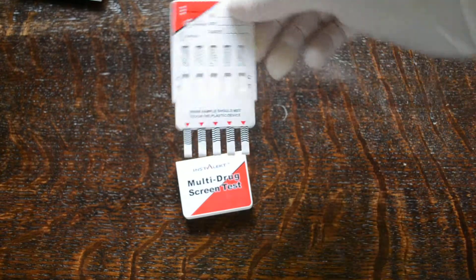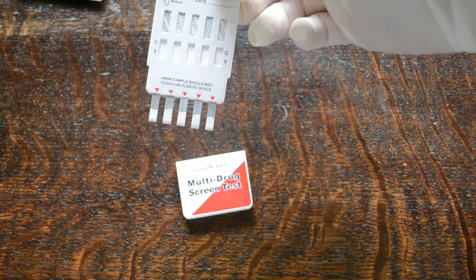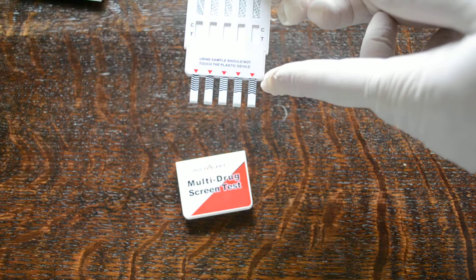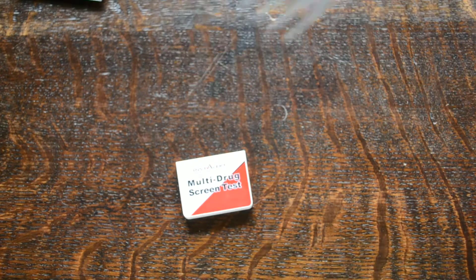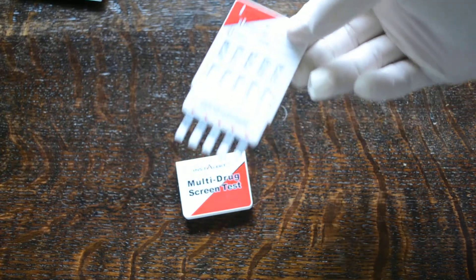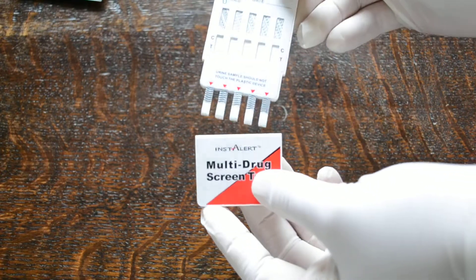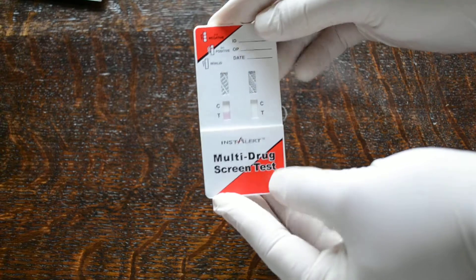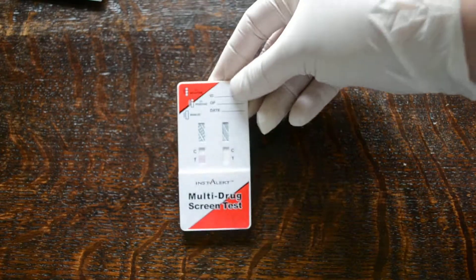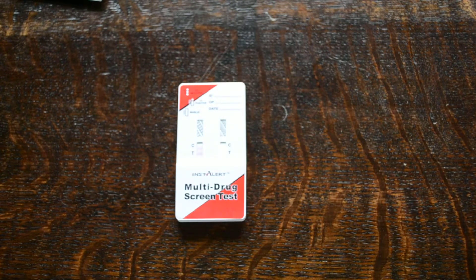Remove the cover — that gives you the prongs with wavy lines indicating the dip level for the urine. The urine mustn't touch the bottom of the panel when it's being dipped. Just dip this into a sample off-camera — it only needs to be dipped for about five to six seconds. By re-covering the panel, these hygroscopic membranes absorb the urine, and with the cover replaced there's no leakage, no touching of work surfaces, and no contamination of the urine sample.